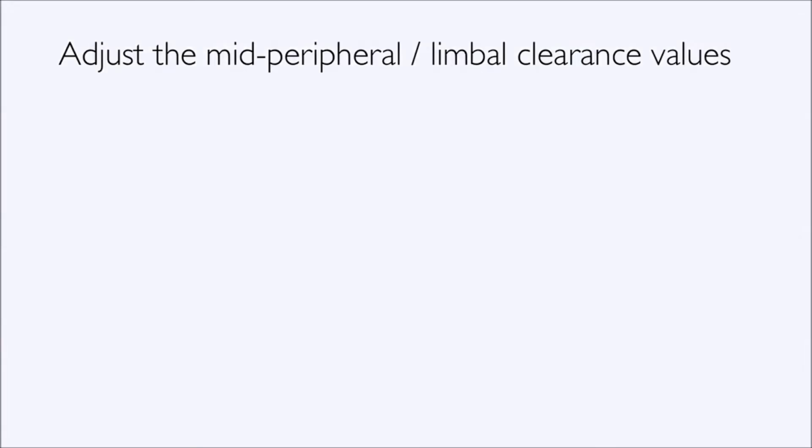Personally, I like to keep my tear layer approximately between 100 and 250 microns from limbus to limbus. It's not always possible because we have the irregular fit over keratoconus or pellucid or post-graft patients. I also want the lens to have some tear flow behind it. So I want to be able to see if tears go behind the lens as the patient blinks.